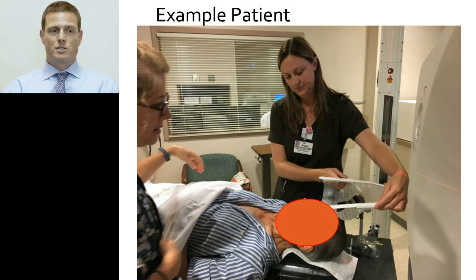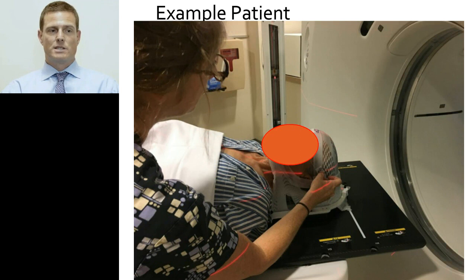So she elected to proceed with single fraction radiosurgery, and we did this all in 1 day because she lives quite a ways away. So she came to the clinic relatively early in the morning. Here's Reagan and Sarah making her plastic mask. They stretch the mask over her face, cool it with the rag and fan. We do attach BBs to the front and the sides.